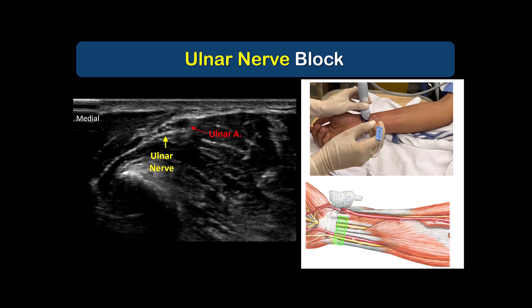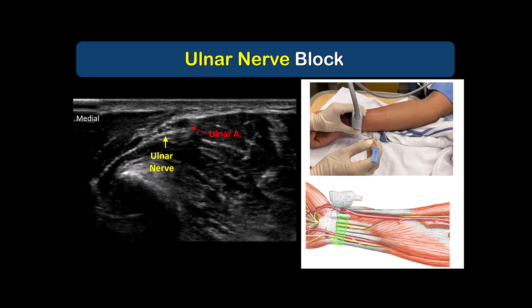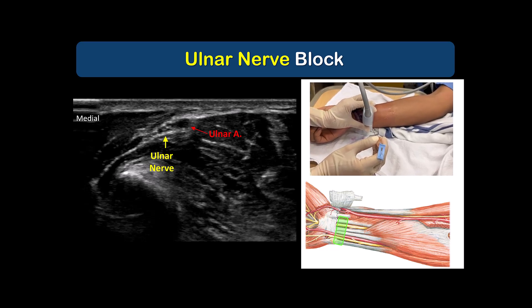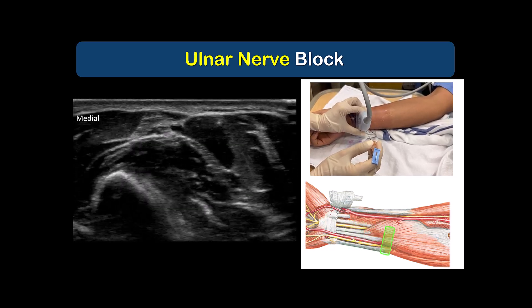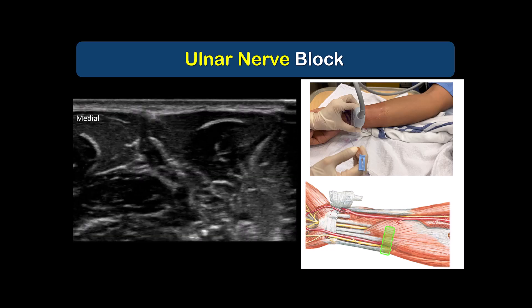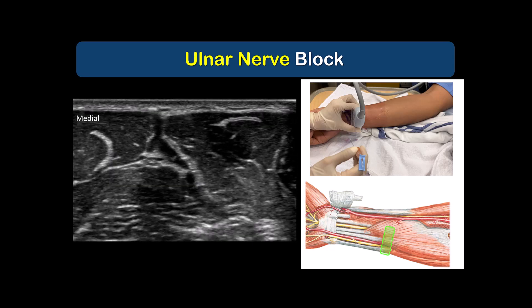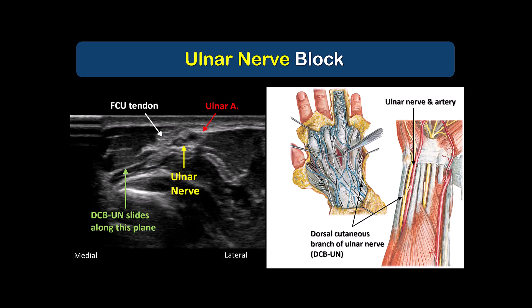With the arm in the same supinated position, we can identify the ulnar nerve. This is most easily done by placing the probe close to the wrist crease over the ulnar artery. The ulnar nerve is always located immediately adjacent and medial to the artery. Both nerve and artery can be traced proximally to the upper forearm where they begin to separate. For a motor-sparing hand block, we do not want to target it in this proximal location. Instead, we want to block the nerve close to the wrist, just as long as this location is proximal to the take-off of the dorsal cutaneous branch and the palmar cutaneous branch.